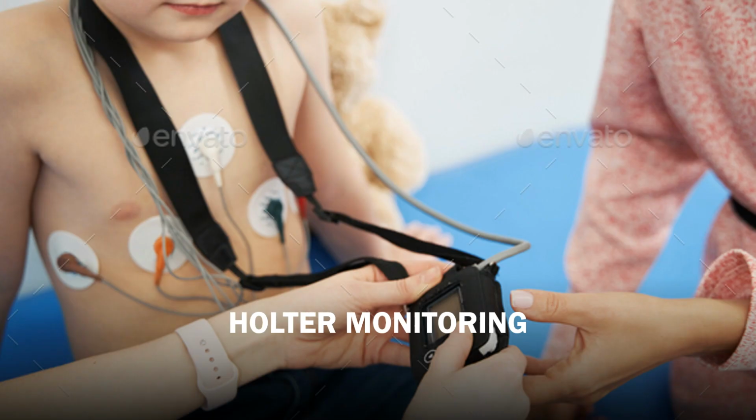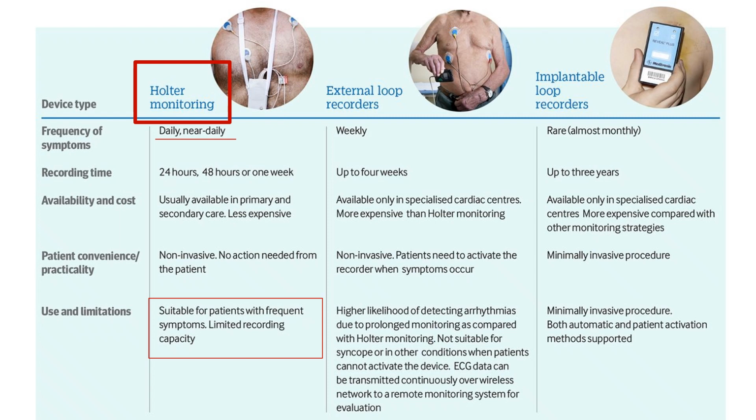Another frequently used investigation is the Holter monitoring. The Holter monitoring is an ambulatory ECG monitoring which can record the heart rate over a period of 24 to 48 hours. Some Holters exist which can record up to 1 week, but this is not available in our unit. Our devices can record up to 72 hours.